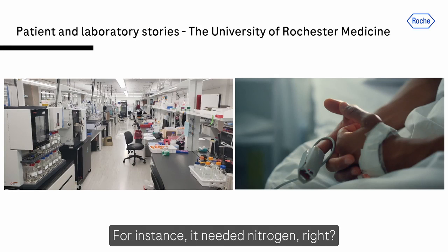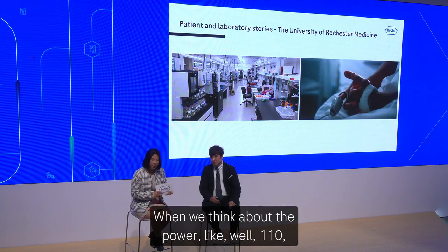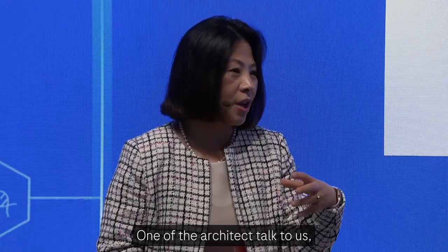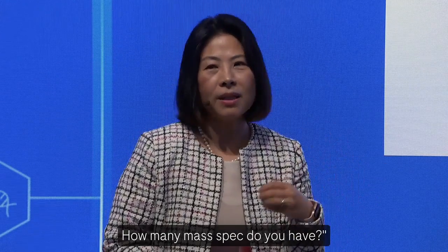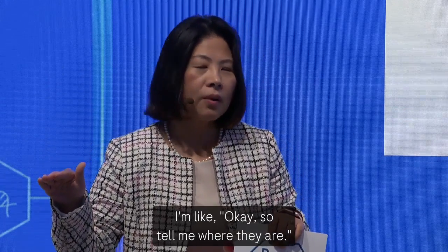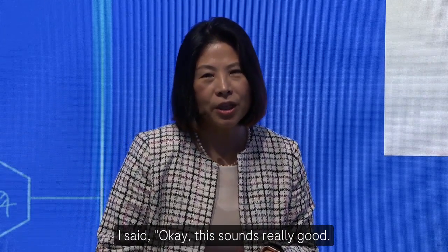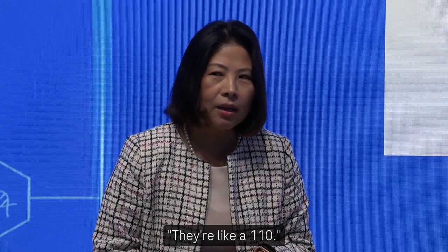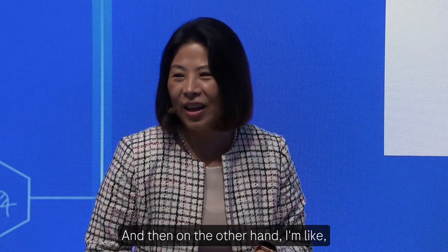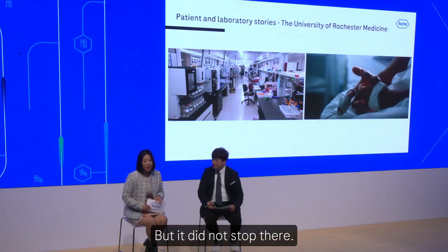For instance, it needs nitrogen, and it takes a lot of power. During the design, one of the architects talked to us and said, we wanted to review how many mass specs do you have? I said, I have a dozen. Okay, I have a dozen plugs for you. I said, tell me where they are. What's the voltage of that? They said 110. I said, we need to change that to 220. And I said, I think there are 2 or 3 plugs needed for each mass spec. But it did not stop there.